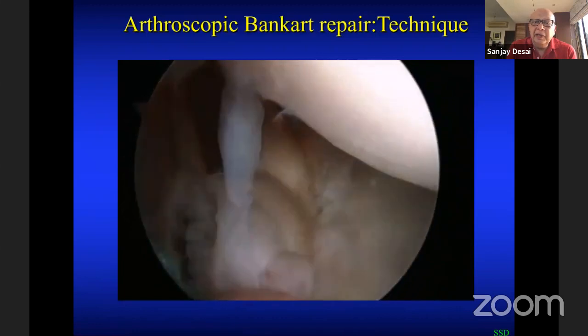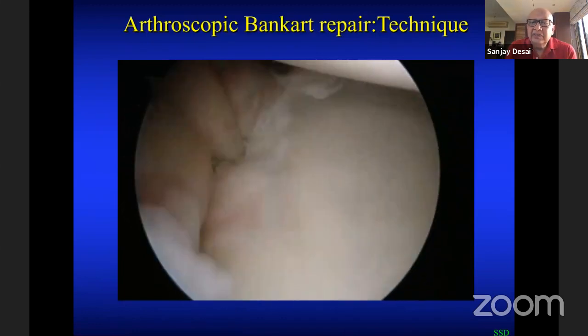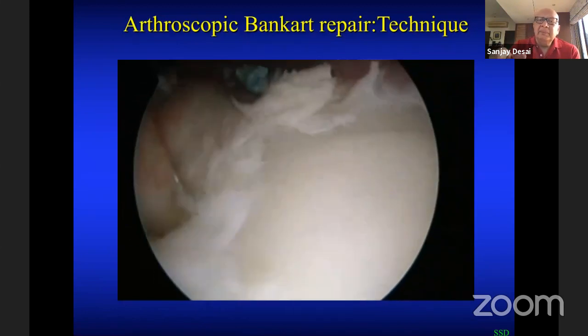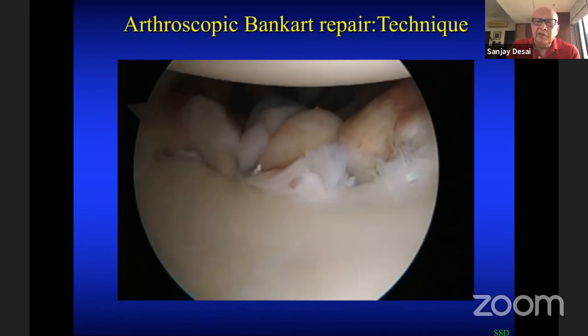And there I have repaired the whole antero-inferior capsule. I can see a large bumper effect. And then I can pass another suture at the posterior inferior part of the glenoid.